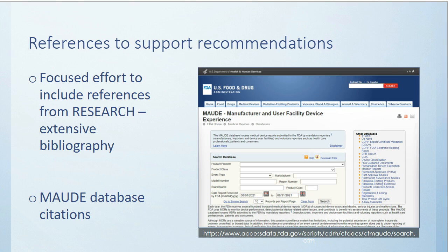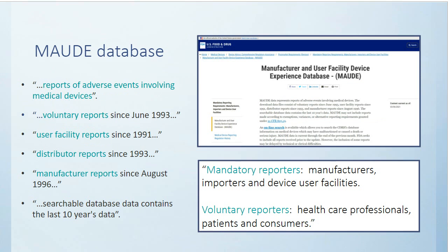But we know you're short on time in facilities, and that's why we went through and included those citations within the document as support. So a little more information on here. As I said, the MAUDE database, it's mandatory for manufacturers and importers and device user facilities to input their significant adverse events such as serious injury and damage in here.